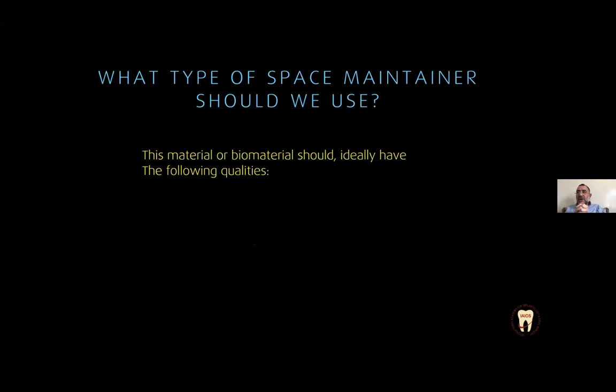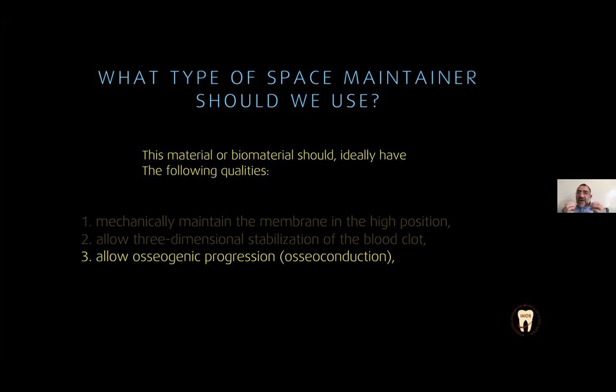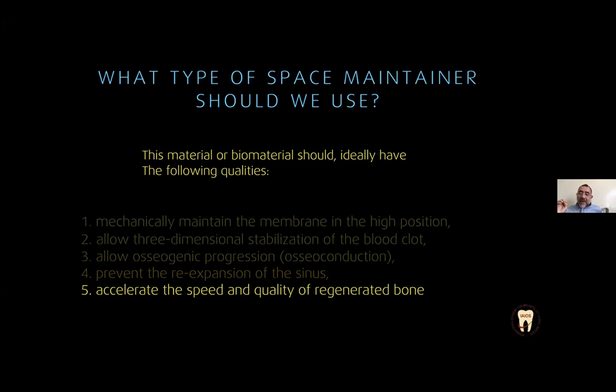This material or biomaterial will have many qualities to give a good result of new bone regeneration in the sinus. With this spacer method, we should be able to maintain mechanically the membrane in the high position, to allow three-dimensional stabilization of the blood clot, to allow osteogenic progression, the osteoconduction, and finally to prevent the re-expansion of the sinus and accelerate the speed and quality of bone regeneration.